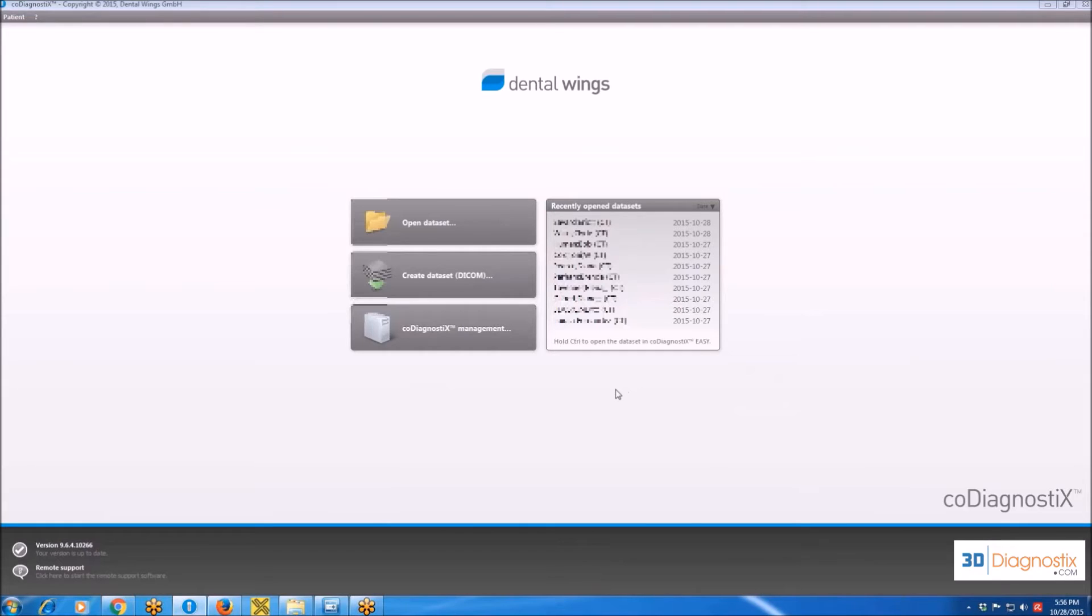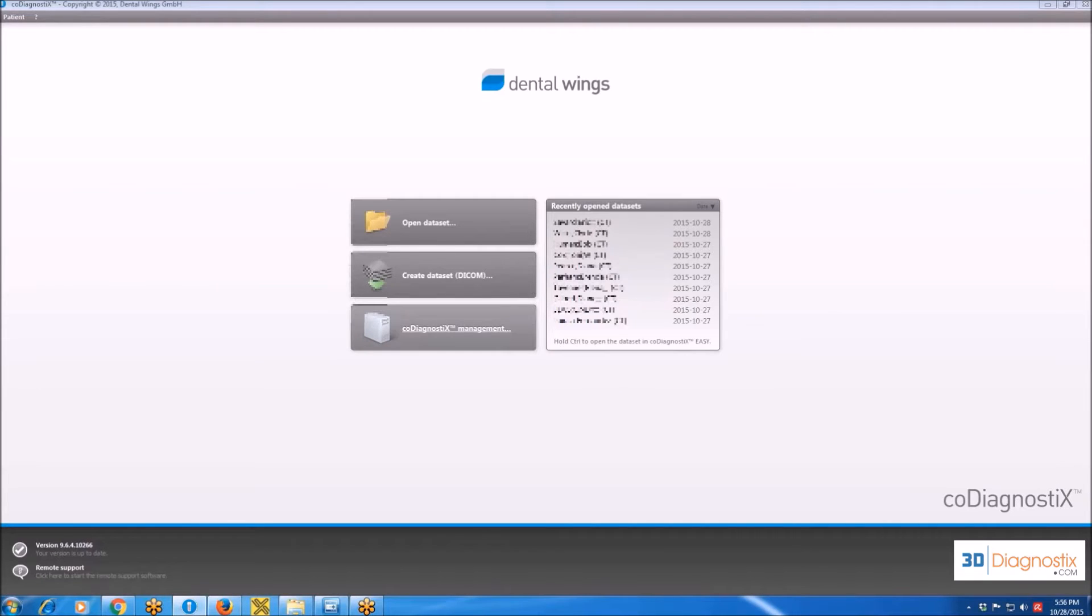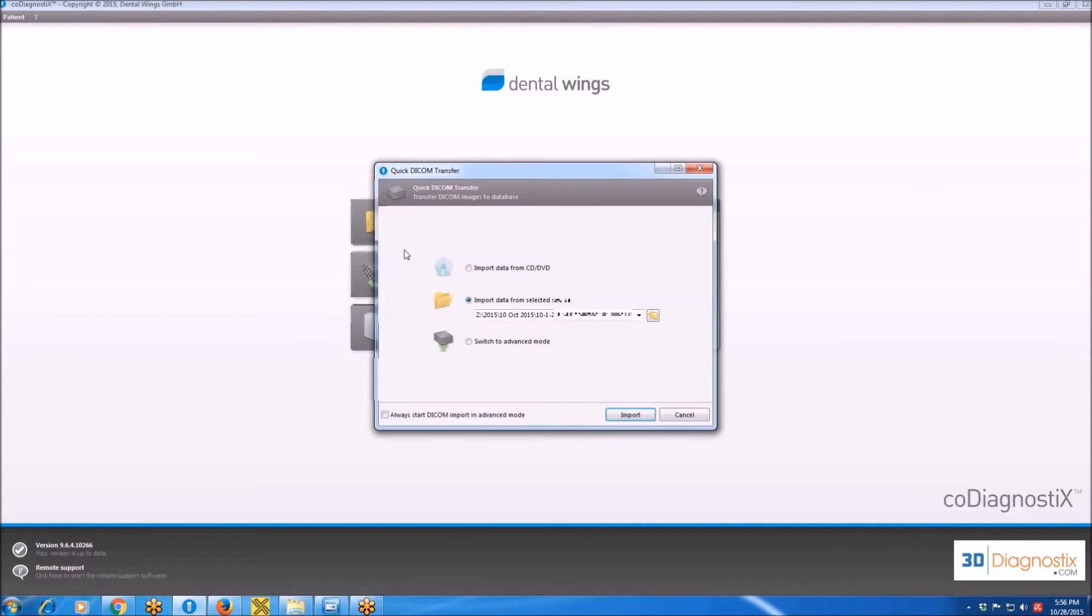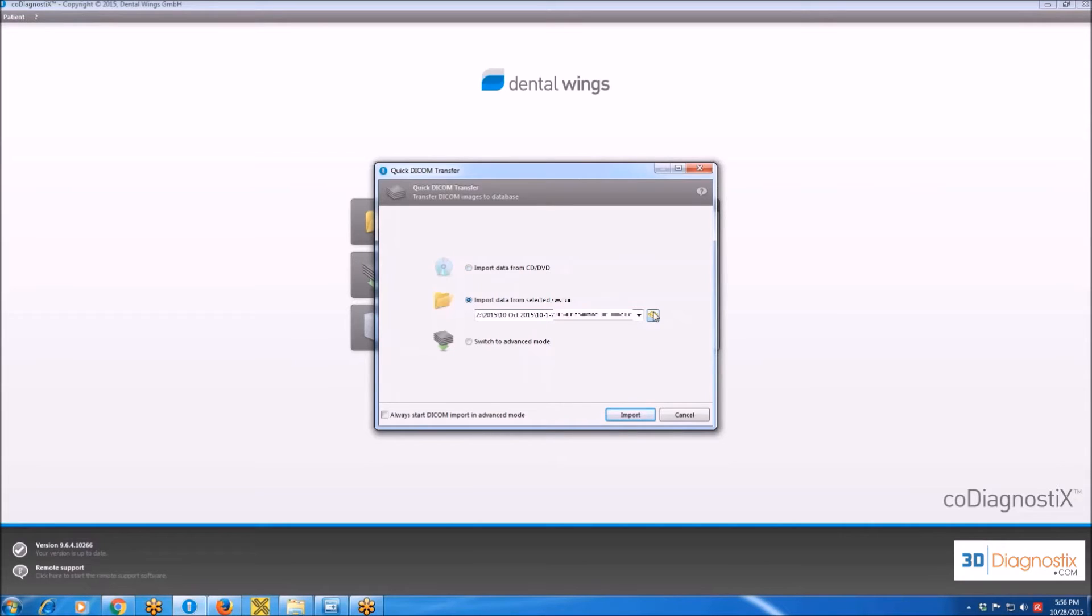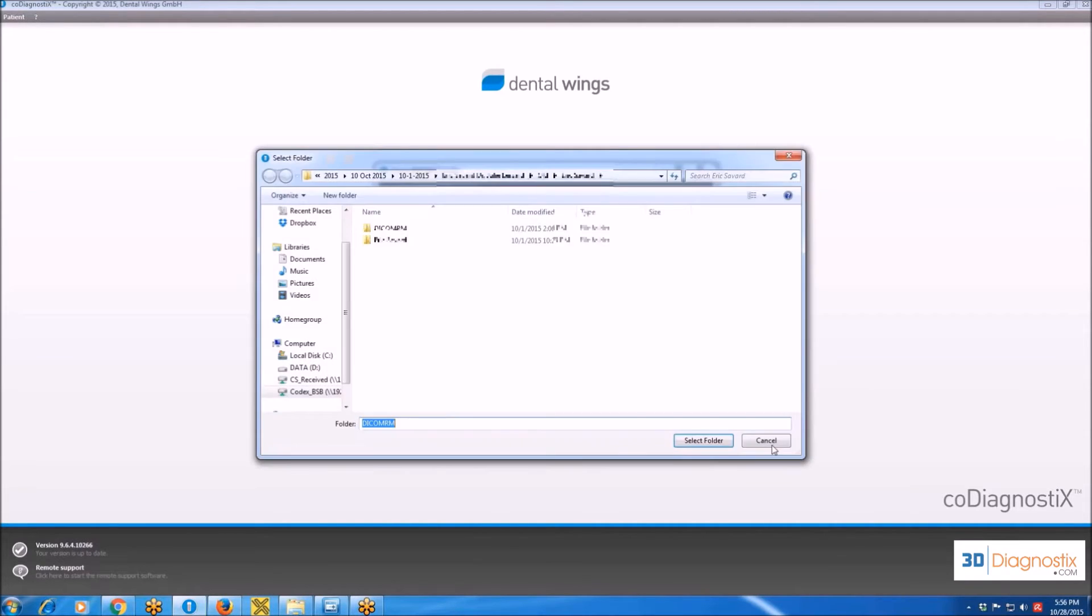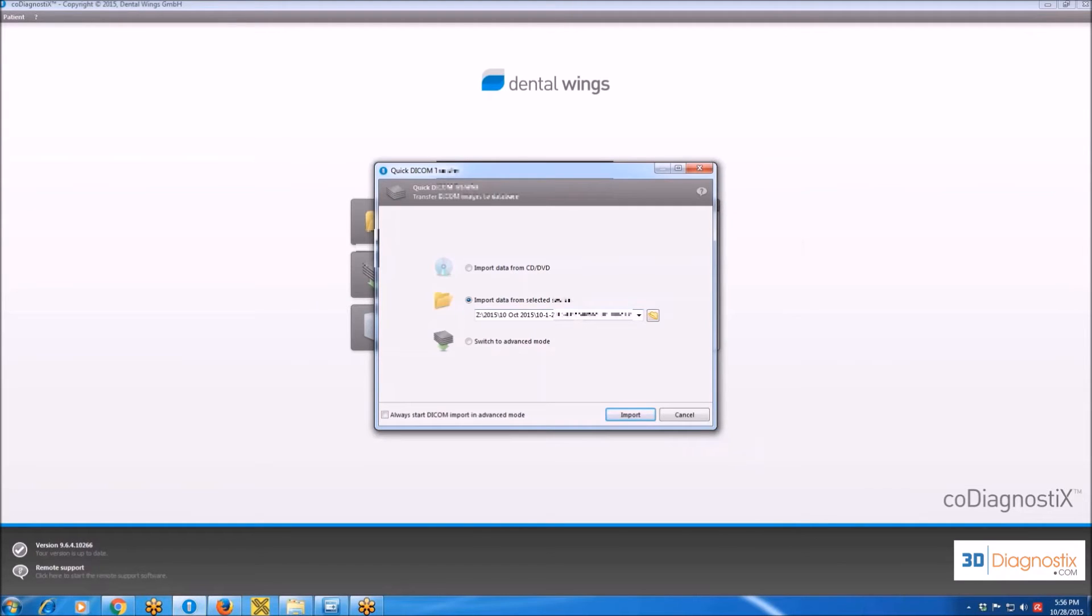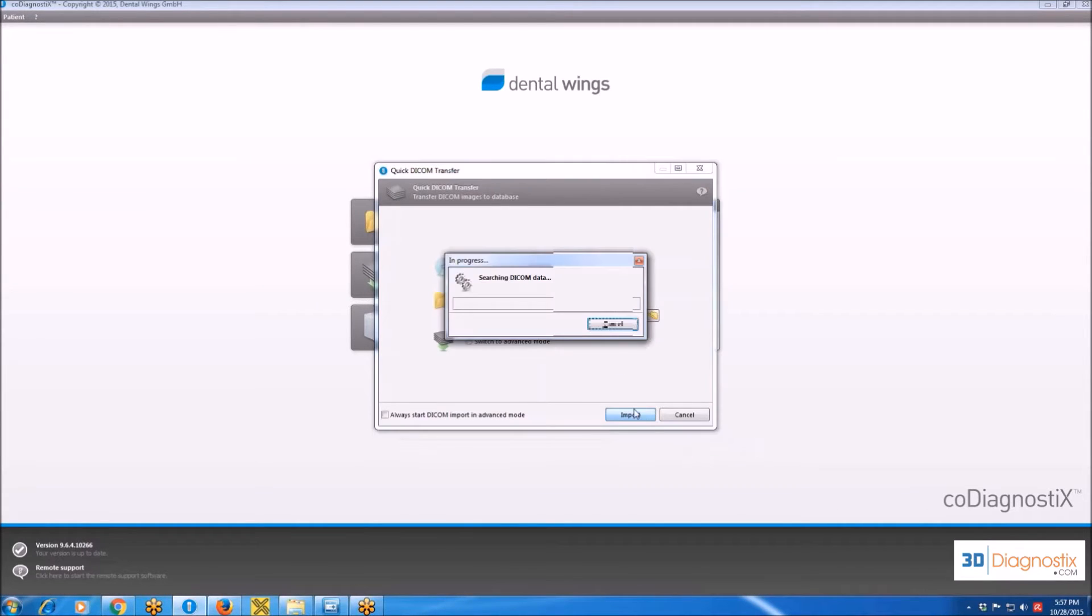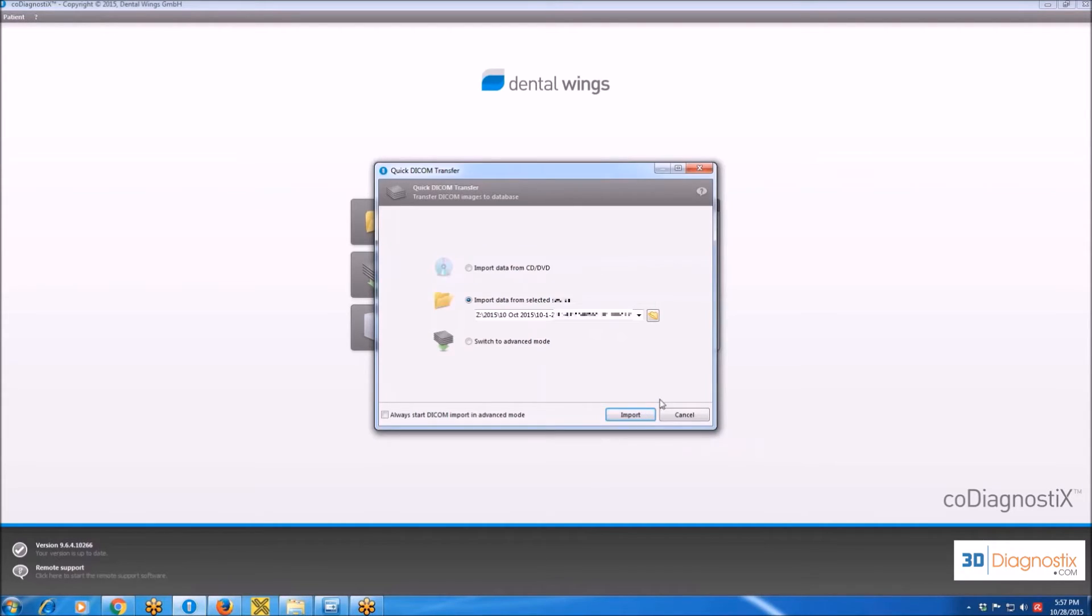In order to import the DICOMs, essentially the data of any scan that come either on a CD-ROM or are already in one of the folders on your computer, you are going to choose the second button here, which is Create Dataset. Once you click on that, you have a couple of options: either import data from CD-DVD or import data from a selected source and choose the folder on your computer. Let's say I choose this folder. Click on Import and it starts searching for the DICOM data on the computer and then automatically imports them into the software and creates a dataset.